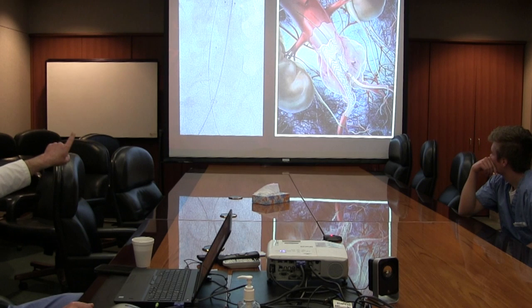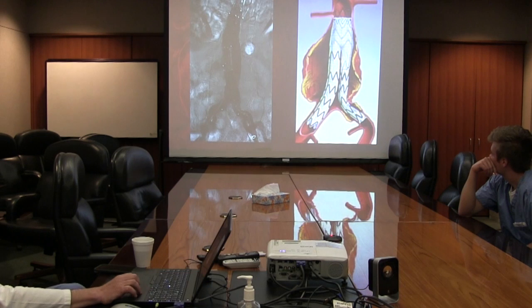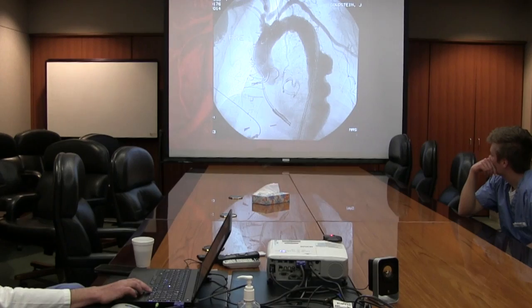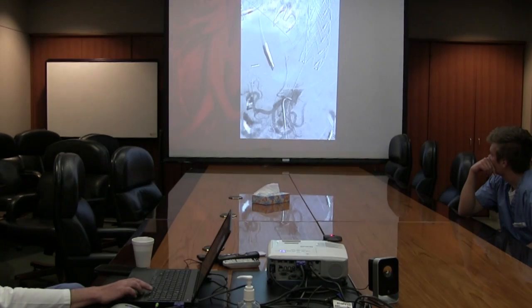We put a wire up through that pant leg, and we put the next components so they kind of interlock, if you will, they overlap. By doing that, we can build the graft. And that's the end of the procedure. We won't talk about thoracic aneurysms, but same thing, we can treat those with stent grafts.